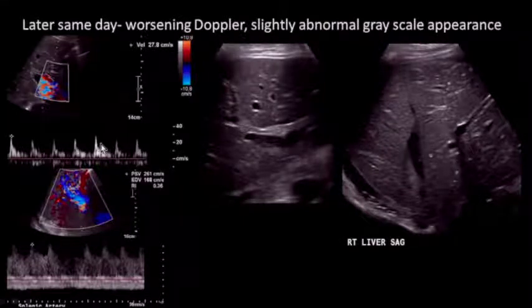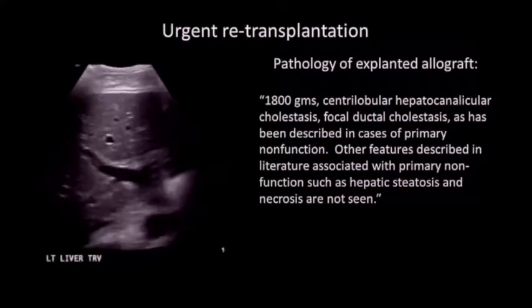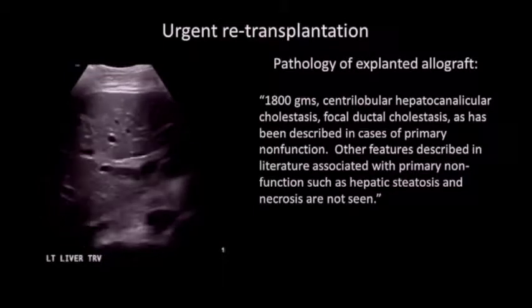By now, we were having lower velocities, high resistance arterial flow in the liver. It was very difficult to find the arterial flow, again, compared to the splenic artery. And now the liver was starting to subtly appear abnormal. As you can see, there is increasing bright echogenicity around the portal triads. There was some pleural fluid and slightly more ascites. And this is a cine clip of the liver that allows you to see brighter echoes around the portal veins consistent with periportal edema.